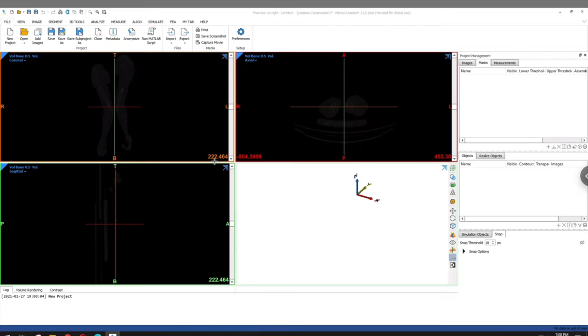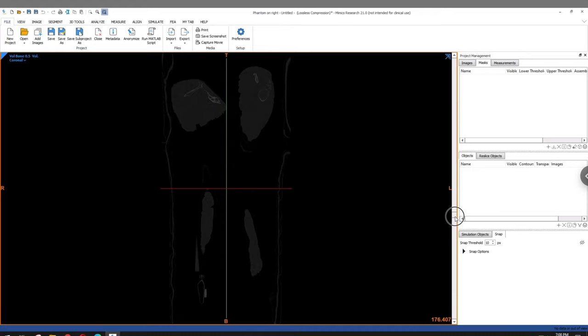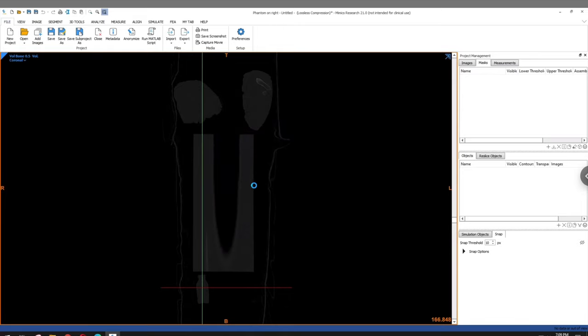A convenient feature in Mimics here is it'll actually auto-name your project to the patient name that was inputted by the CT technician originally. Now you can see here I'm just indicating what's known as a phantom, so that's just a bottle of water. On the right, humerus is indicated in the title of this particular CT image, and it'll just help me isolate which is the left arm and which is the right arm, as in this particular example for my study, I need to isolate and create a 3D model of the left humerus.